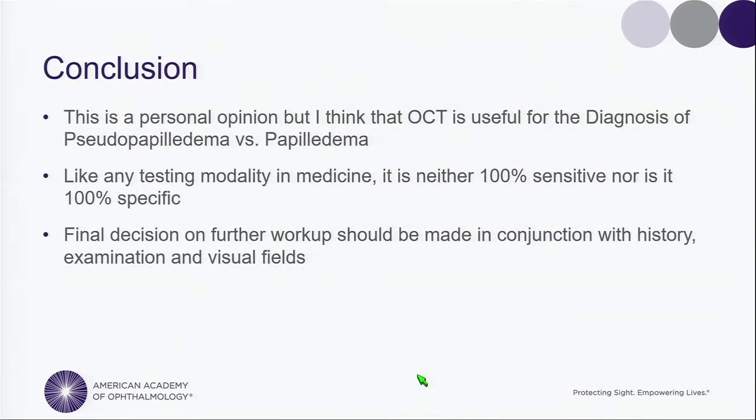So in conclusion, this is a personal opinion, not a recommendation. I think that OCT is useful for the diagnosis of pseudopapilledema versus papilledema. Like any other testing modality in medicine, it's neither 100% sensitive nor 100% specific. And the final decision on further workup should be made in conjunction with the history, examination, and visual fields.